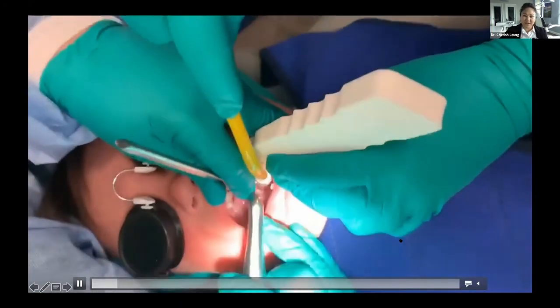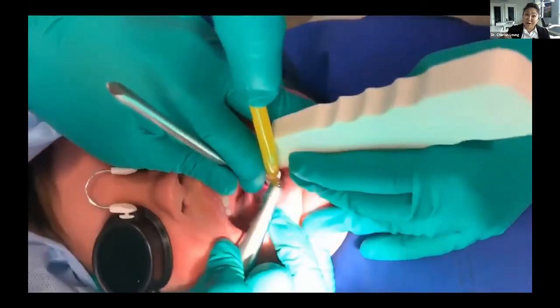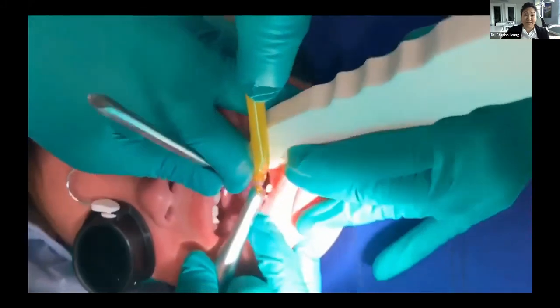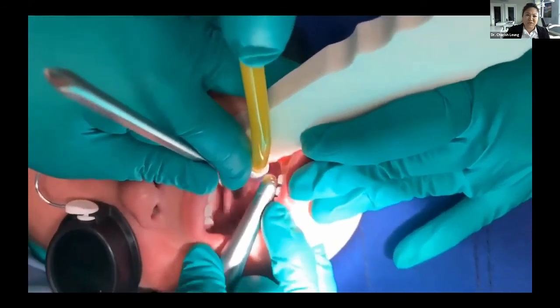So this is my little toddler who was fun. He was actually good. So his head didn't move much. He just cried, but that's fine because I know we're not hurting. They're protesting actually because you're holding their tongue up and they don't like that part. That's actually where I get the most protest. And so I just let the parents know that in the beginning. They're going to cry because I'm holding their tongue, but it doesn't hurt. And then they're usually fine with that.